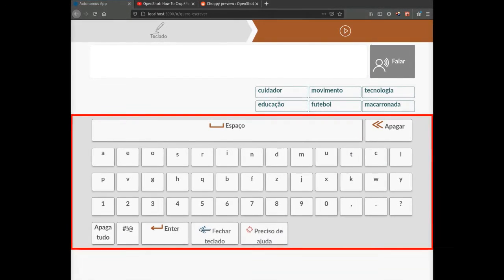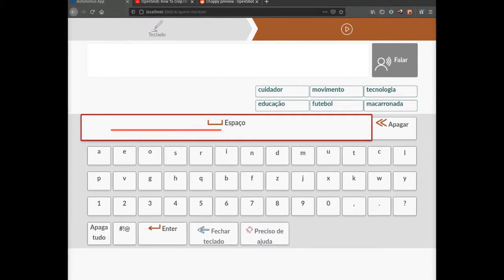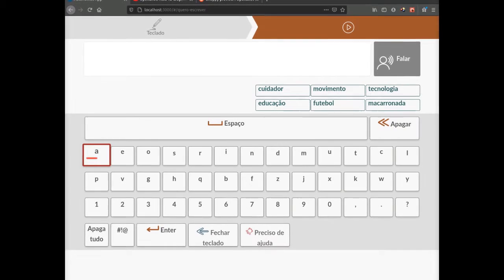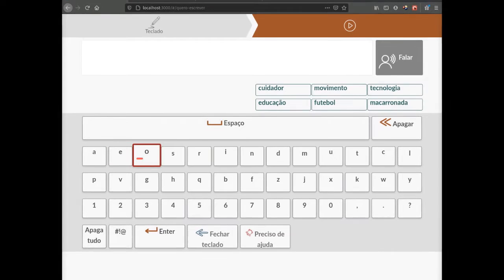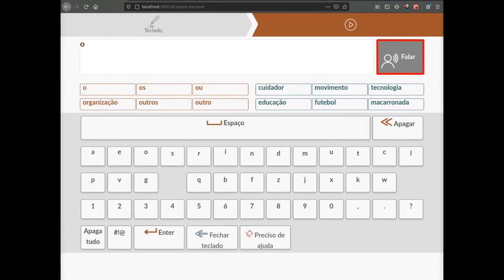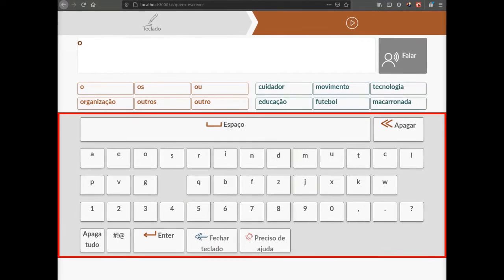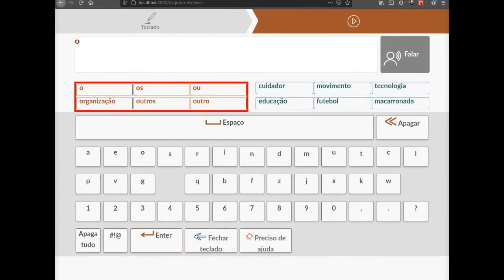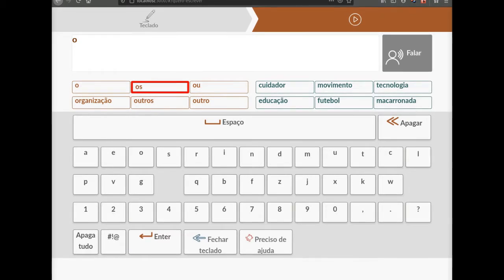Letters sorted by most frequently used in the Portuguese language. As we are using a timer to move from a region to another, ordering the letters this way improves the typing speed. Key negation. Another way to improve typing speed is to not show letters that do not follow the one that was typed before. As you can see, the scanner jumps all negated letters.